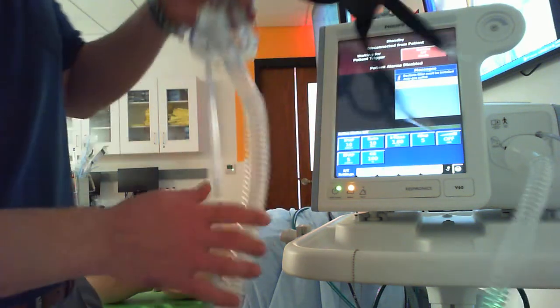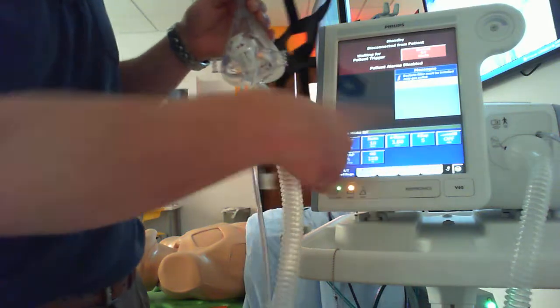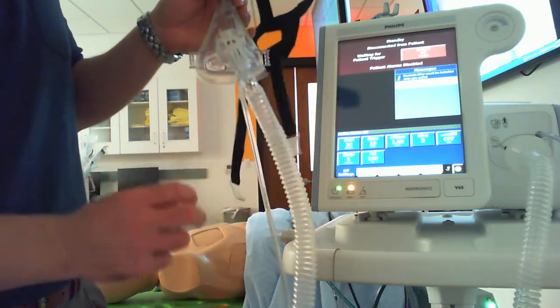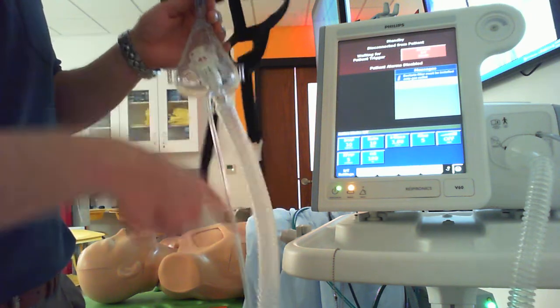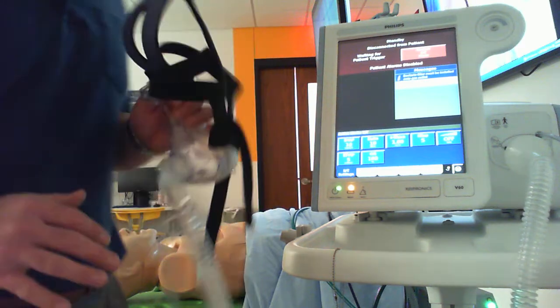EPAP, so the thing to keep in mind is a single limb circuit. It creates pressure by constantly pushing flow through, right? And it's measuring that pressure achieved right here at this exhalation port, this proximal pressure line. You can't go any lower than 4 centimeters of water, okay? And the reason being, if you set any lower, there wouldn't be enough baseline flow to flush out CO2. So 4 would be the utmost lowest.